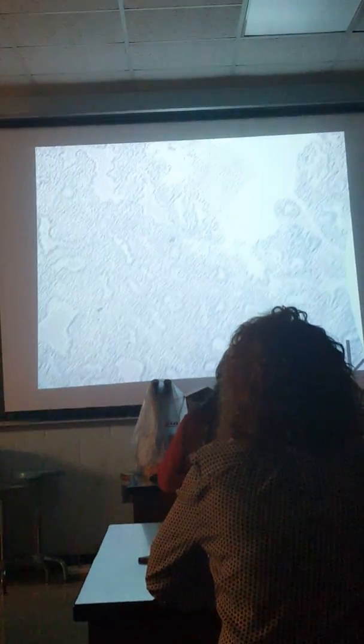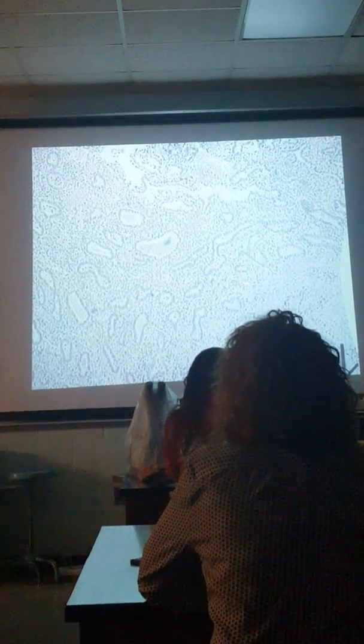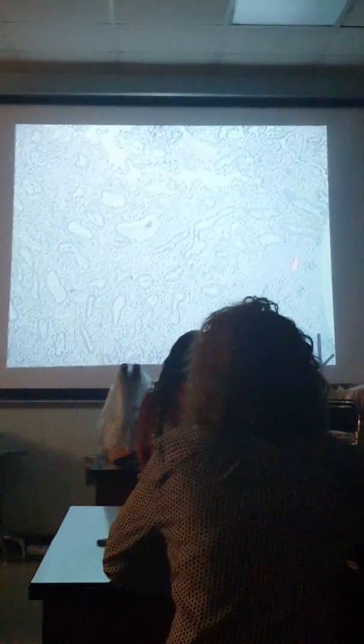But you can see the endometrium, especially stratum functionalis, is beginning to break apart. You see hemorrhaging, but then stratum basalis is still going to be intact. The stratum basalis needs to be there because that's what's going to develop and grow during the proliferative phase, and then again back through the progravid or secretory. This is all myometrium. Okay. So that's uterus.